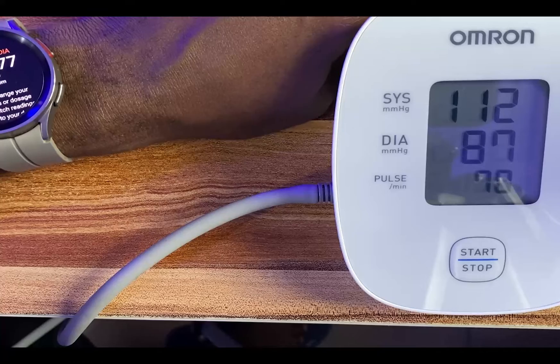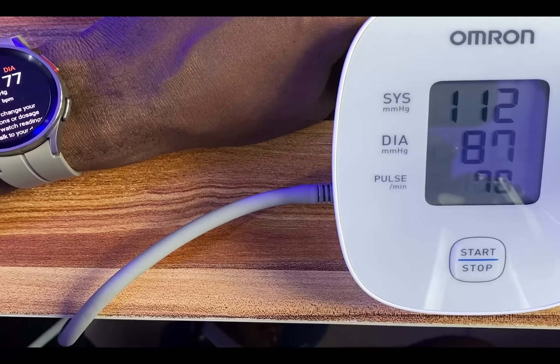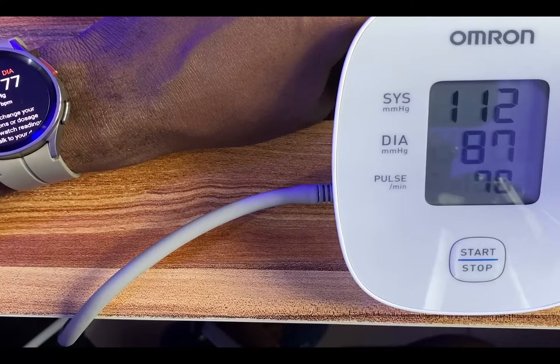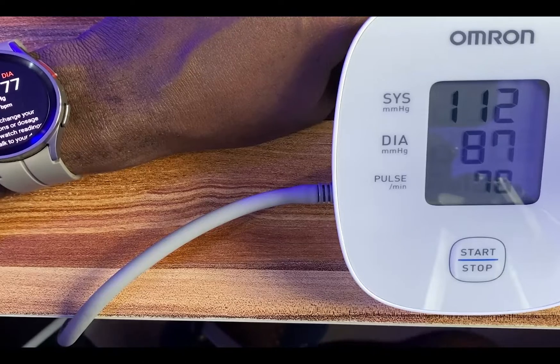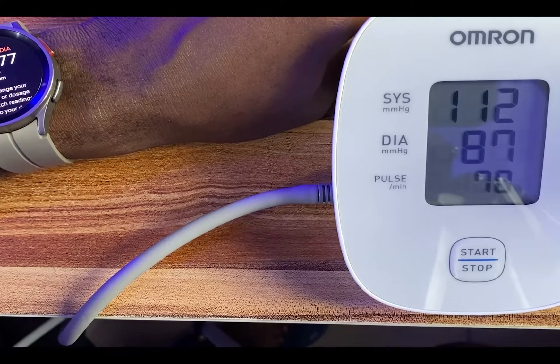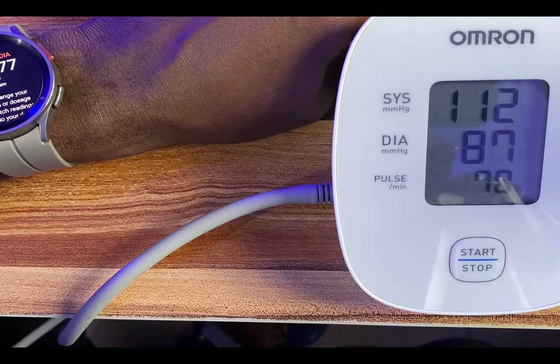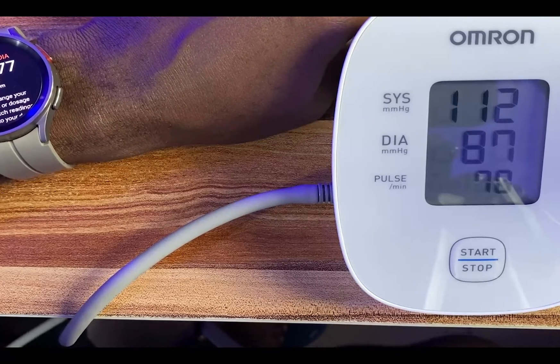I have the first measurement on the Galaxy Watch 5 Pro. It is 112 over 77, and the heartbeat is 71 beats per minute. For the Omron blood pressure monitor, it is 112 over 87 and the pulse rate is 70 beats per minute.